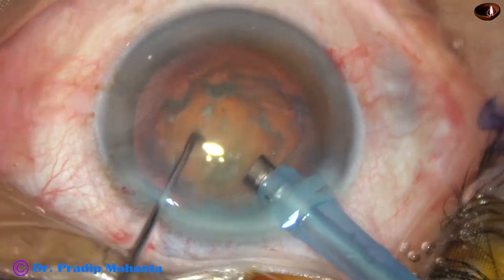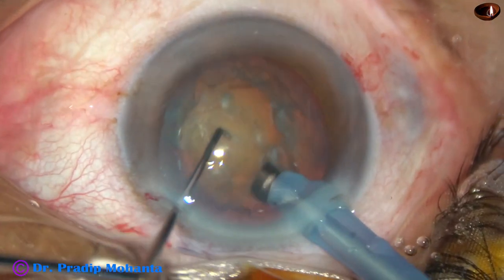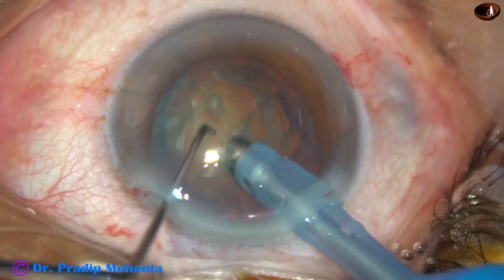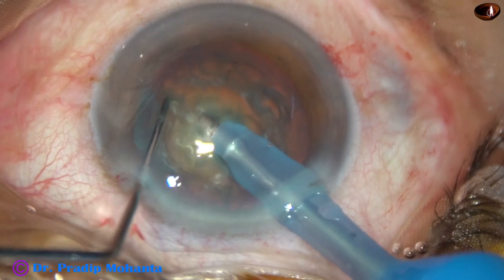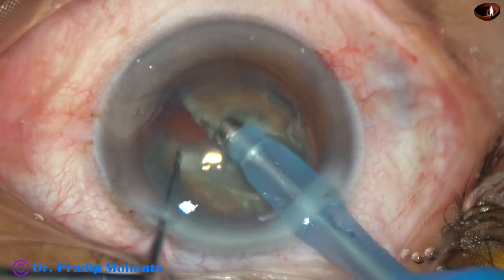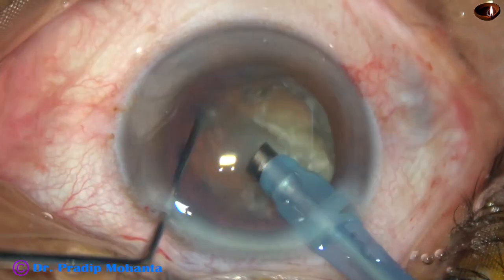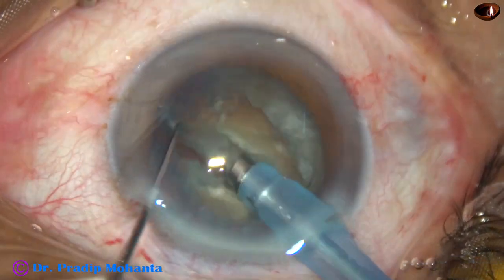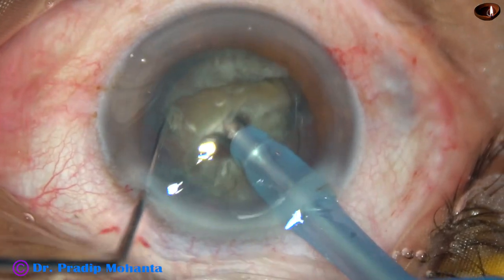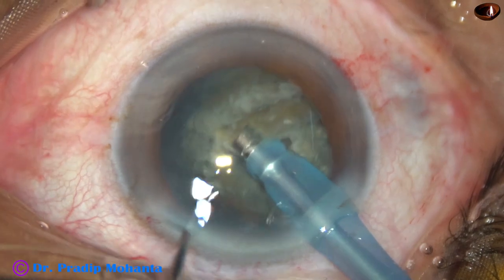And now watch the submarine chop for this grade 3 nuclear sclerosis. The nucleus is pushed a little down. The tip is buried just in front of the main incision into the nuclear substance. It goes through the substance as the submarine moves through water. Crosses the central part. And then the chopper is used to divide the nucleus into two heminuclei. One 180-degree rotation and the two heminuclei are completely separated.